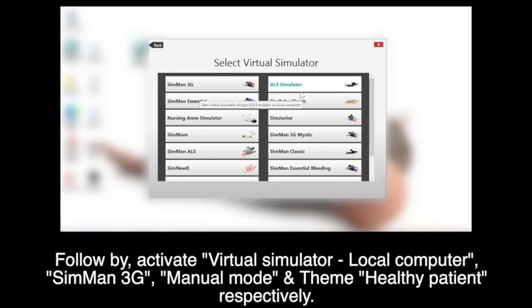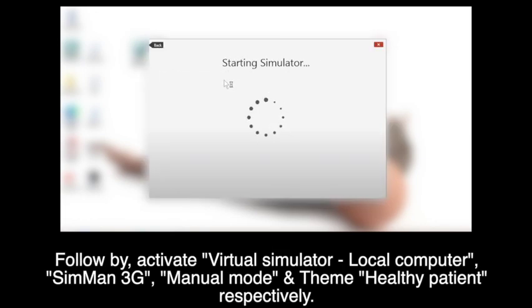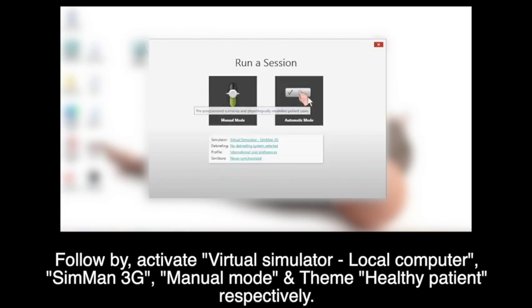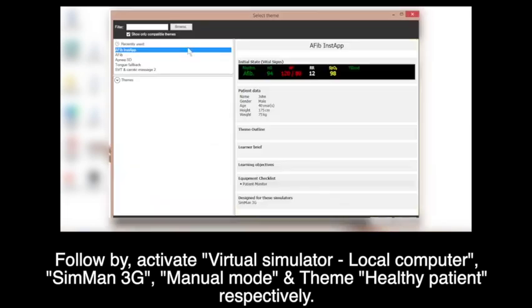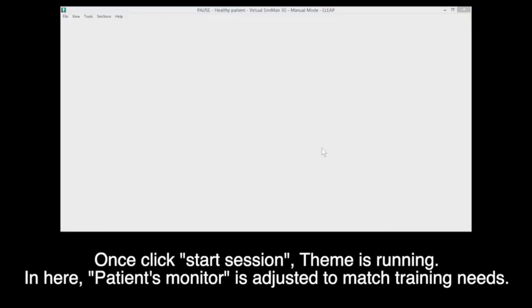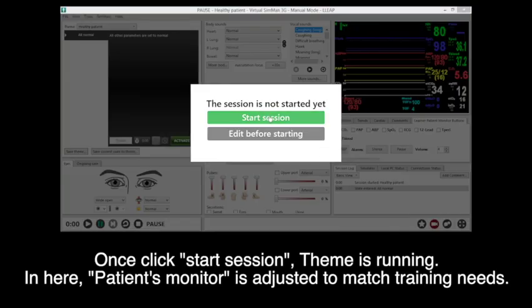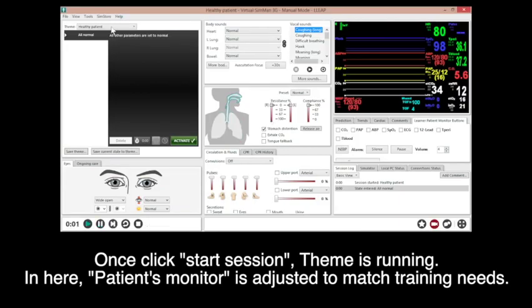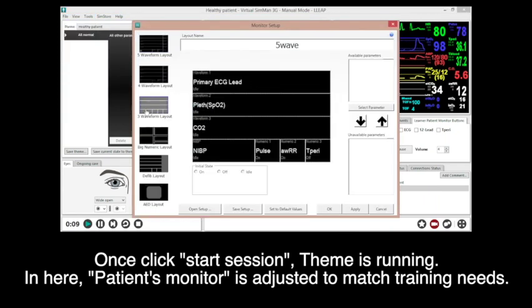Followed by activating Theme programming: virtual simulators, local computer — in my case, SIMMAN 3G — manual mode, and Theme healthy patient respectively. Once you click start session, the Theme is running. In here, the patient monitor is adjusted to match training needs.